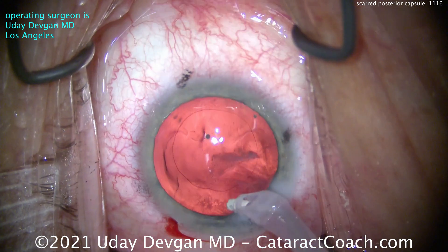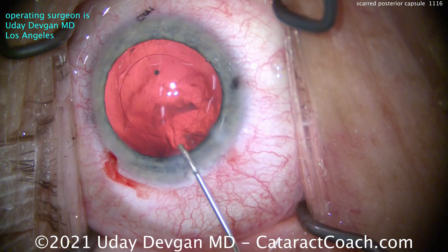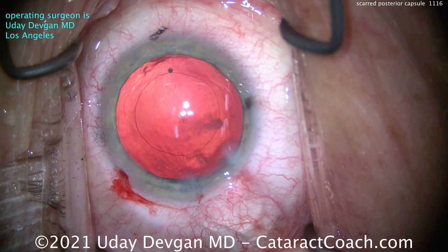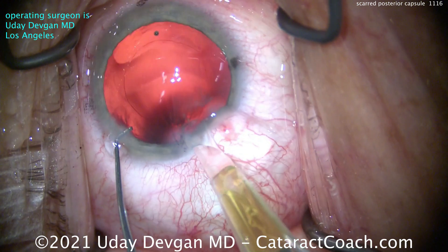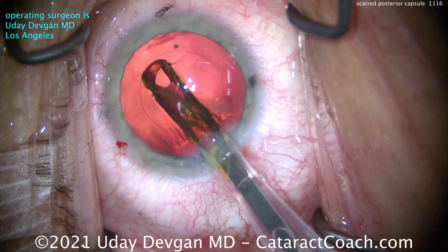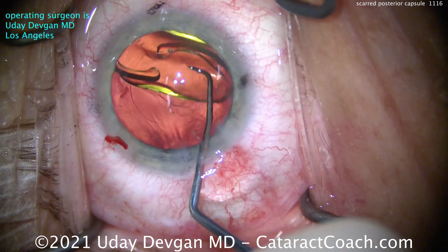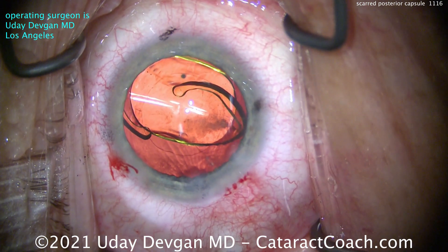You can also try again once the IOL is placed in the eye, so we don't want to damage the capsule now. Remember this patient needs a toric lens for two and a half diopters of corneal astigmatism. Let's fill the capsular bag — there you see the opacity; it's just to the side of the visual axis. You can see the Purkinje images are slightly away from it, so it's not directly in the visual axis just yet. Let's get the lens in. Here's our single-piece acrylic toric lens; the main phaco incision is made on the steep axis.